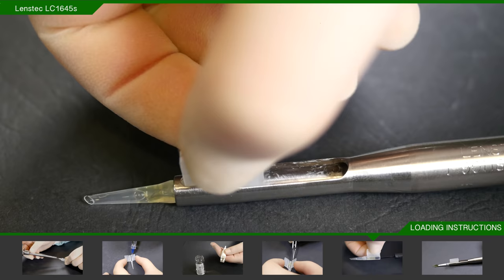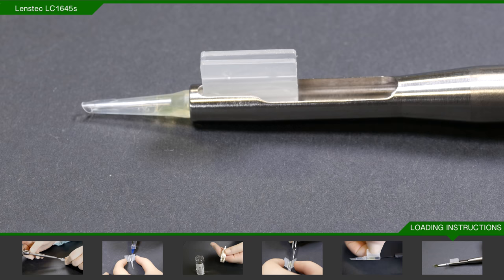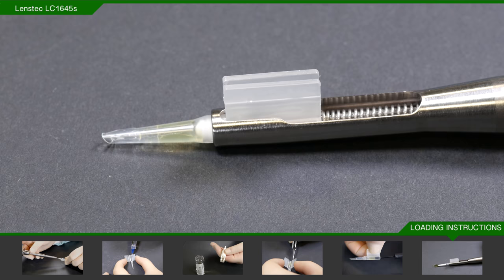Straight away, take the injector and place the cartridge angled slightly downwards into the loading space at the top. Push it in all the way so that the closed flaps of the cartridge butt up against the front end of the loading space. Then either push or screw the plunger into the back of the cartridge and advance the lens until you can see the white plunger tip at the start of the barrel.